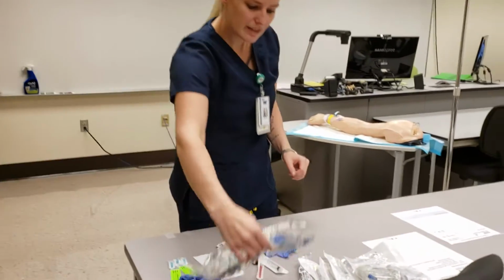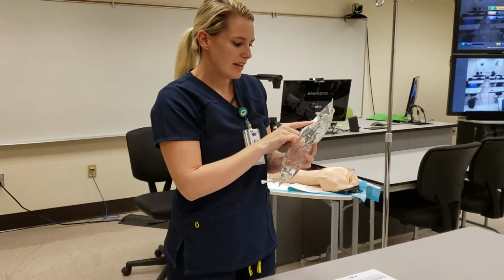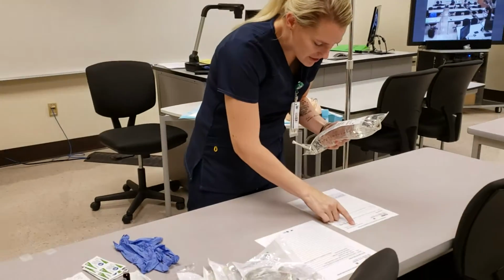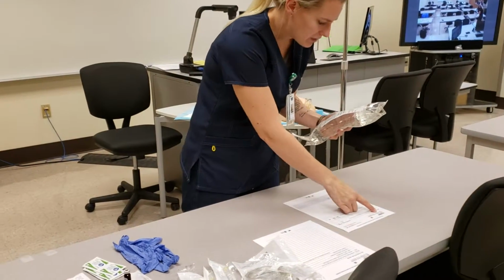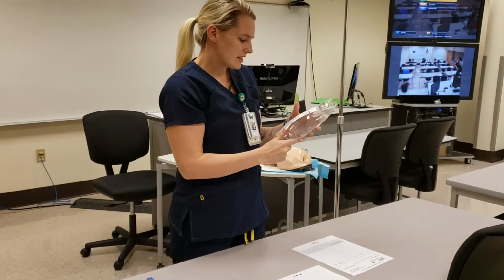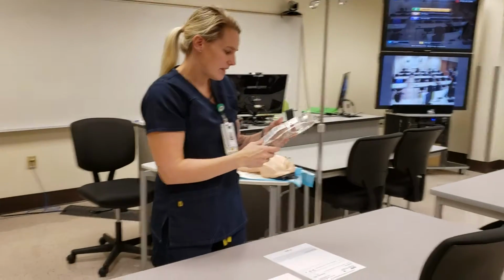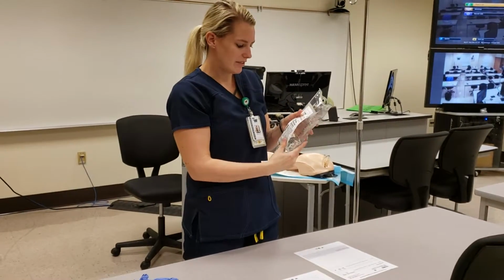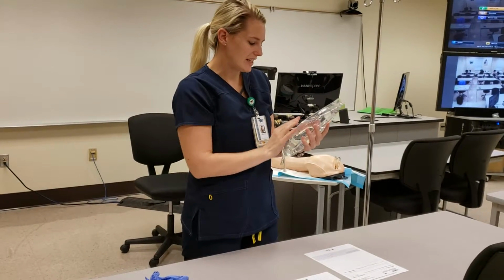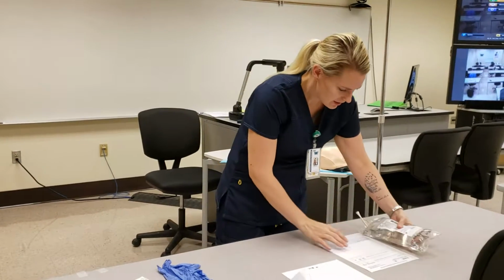So I have here my lactated ringers. It has my patient's name and date of birth on here, and that matches Shirley Cost 5/14/64. So this is already prepared by the pharmacy, 20 milliequivalents of potassium in 1,000 milliliters of lactated ringers. The bag has not been tampered with. There are no leaks or tears, and the solution is clear, so that's good.